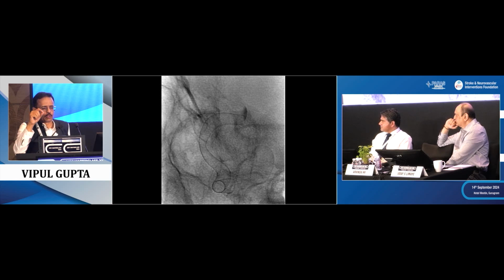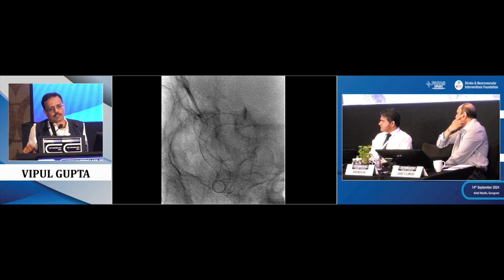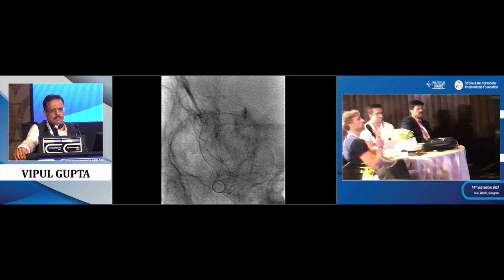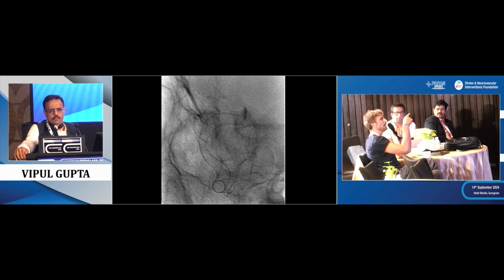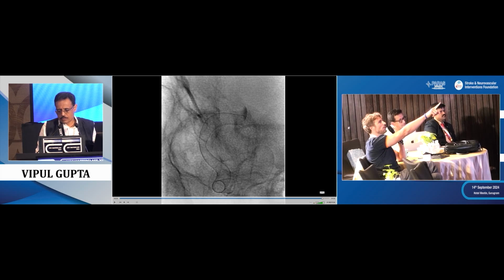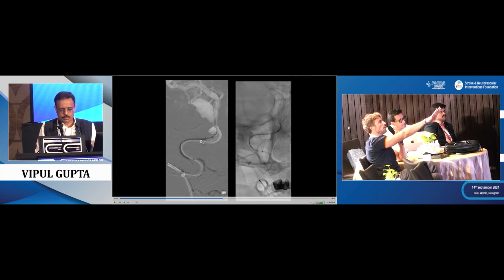Just one small question and then I'm done with this. Why do you think we had a problem opening up the stent in that cavernous area? Why wasn't it opening up? For me, it's twisting, I think. Yeah. Because the risk factors for twisting are curvy access and a long stent. Because what's happening when you are putting the distality of the stent, you are anchoring your stent.